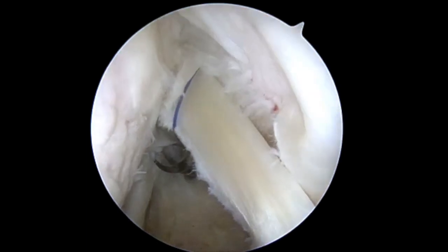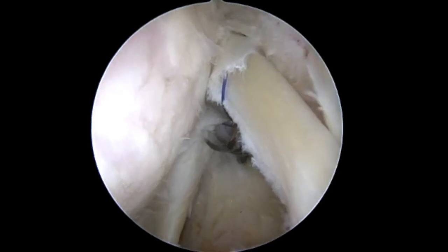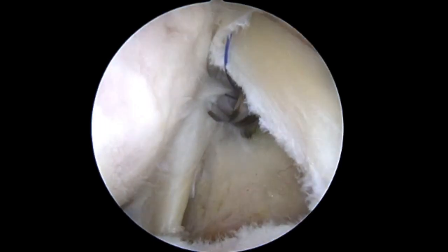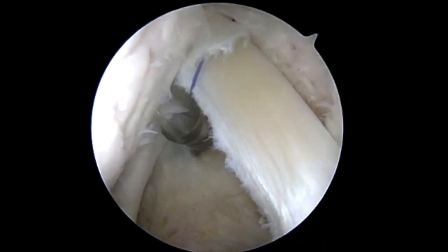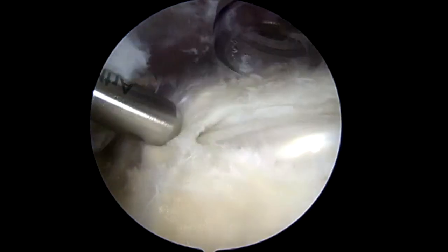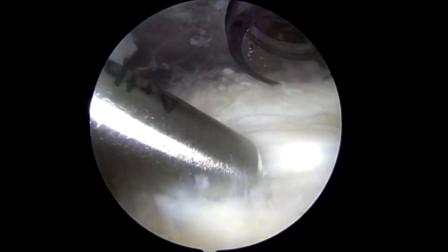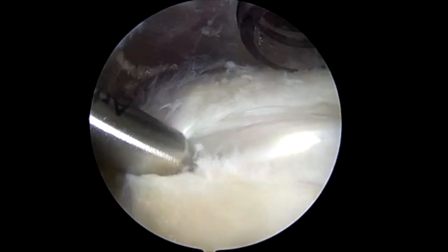After diagnostic arthroscopy, the biceps tendon is marked on both sides through the rotator interval using two number zero Prolene sutures inserted through an 18-gauge spinal needle and retrieved from the anterior portal. The arthroscope is moved into the subacromial space where the biceps tendon and bicipital groove are localized by palpation and the Prolene sutures.